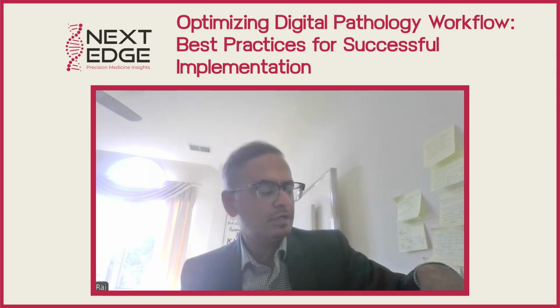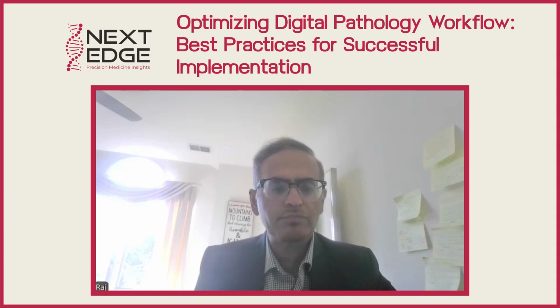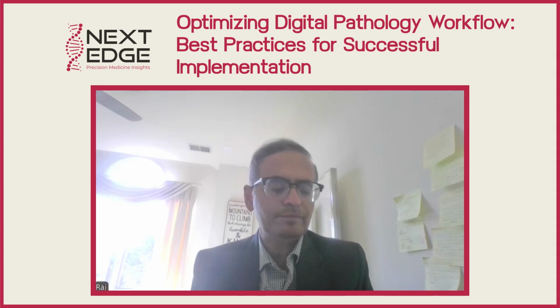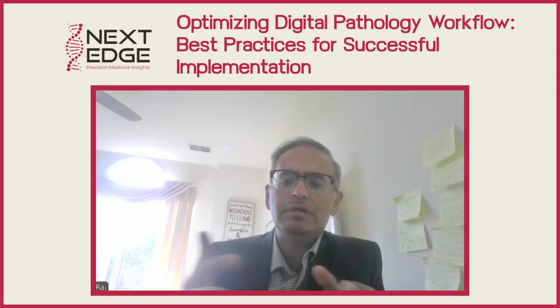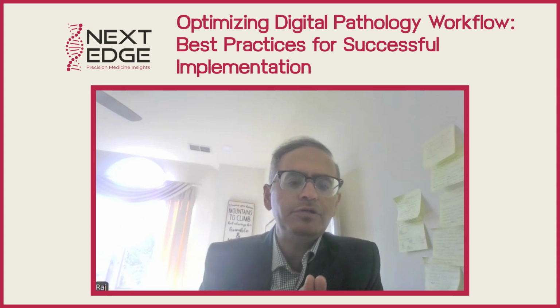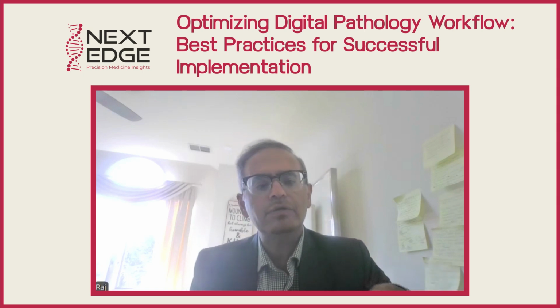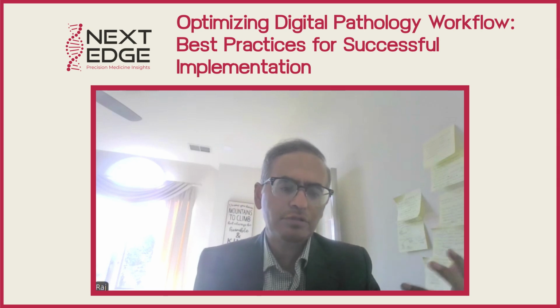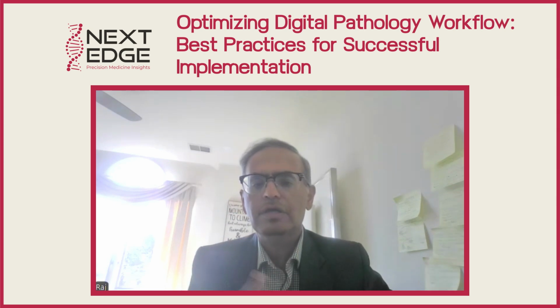And also, very critical for AI vendors, or for people that are providing a digital pathology solution, is to understand that for a pathologist, if you provide them with an AI solution that is not connected to the lab information system where they are going to sign the case out, or where they're going to see the patient data, then that AI solution is of no real big use, because it can be used as some kind of research tool. I can use it for some kind of research protocol.